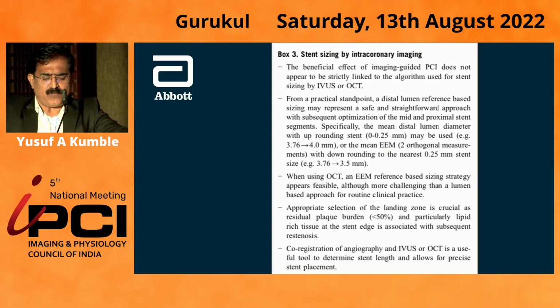Appropriate selection of landing zone is crucial, as residual plaque burden, particularly lipid tissue at the stent edge, is associated with subsequent restenosis. Co-registration of angiography and IVUS or OCT is a useful tool to determine stent length and allows for precise stent implantation.